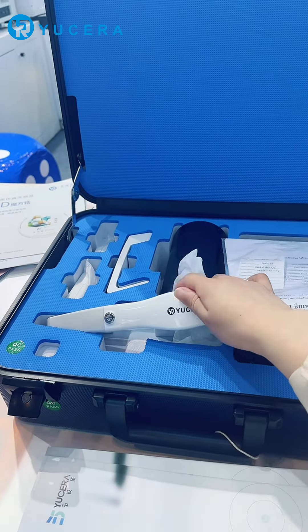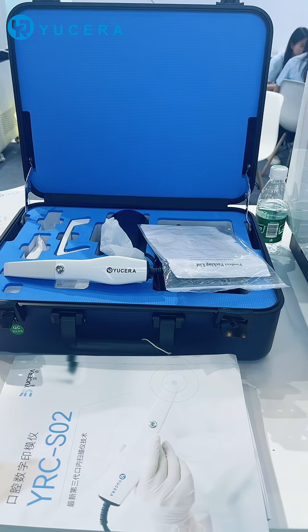Secondly, most scanners use blue-line scanning, but this scanner uses laser scanning, which makes it a very cost-effective scanner.